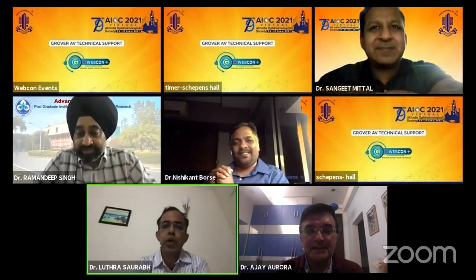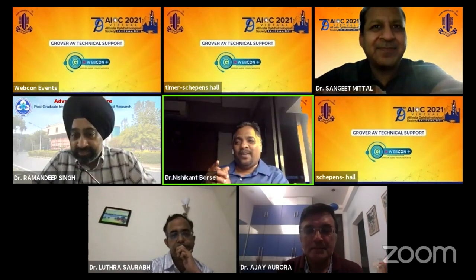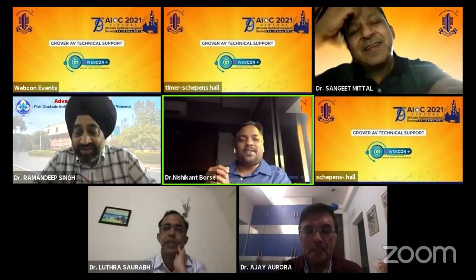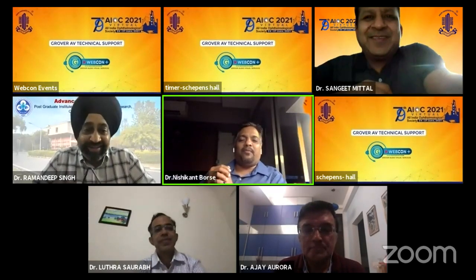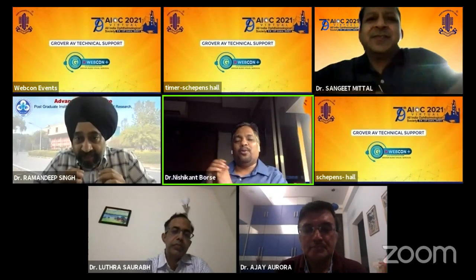Have you seen a foveal blowout with the air, and how do you prevent it? Yeah, Sangeet has got a very interesting video on that. It's your TPA blowout, TPA plus air blowout, not the choroidal blowout. I wanted to know if you've had any issues. Sangeet has got a video in which the air was injected too fast and there was a blowout. So you have to be very careful in injecting. It has to be very slow. If you go fast, then definite macular hole.